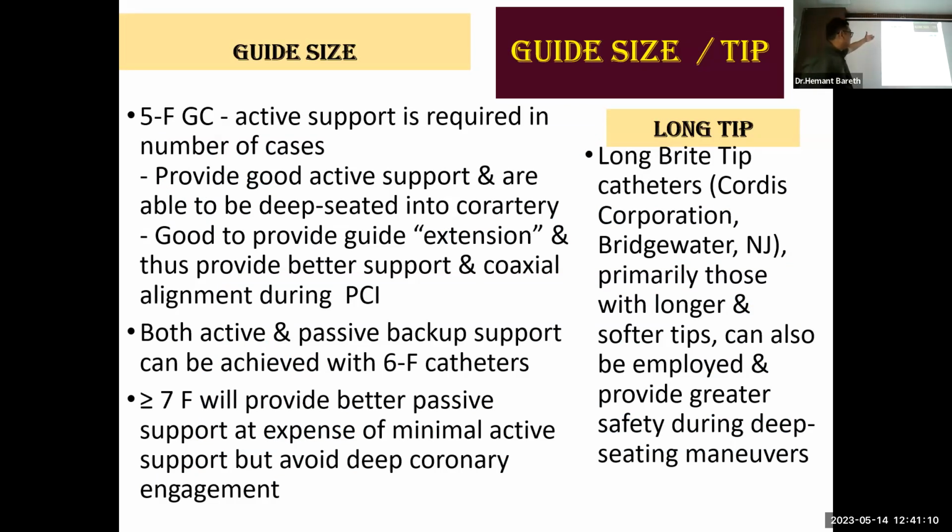So guide size, as I said, the guide will require active support in most cases, and it will require to be supported. But the good thing is you can deep seat it. You can take it inside because the size of the coronary will permit taking it inside, and it can actually provide a guide extension by deep seating inside, and it can give a backup. 6F is the regular one. 7F will give you more support. Long tip, as I already discussed, will give you more support.